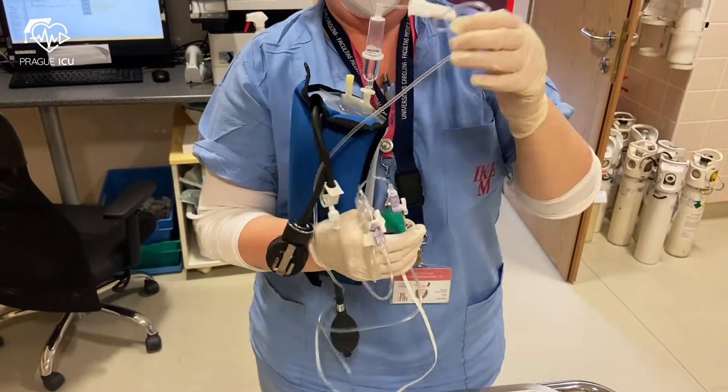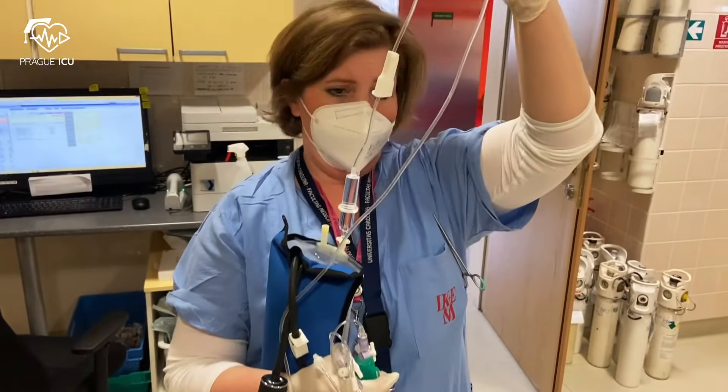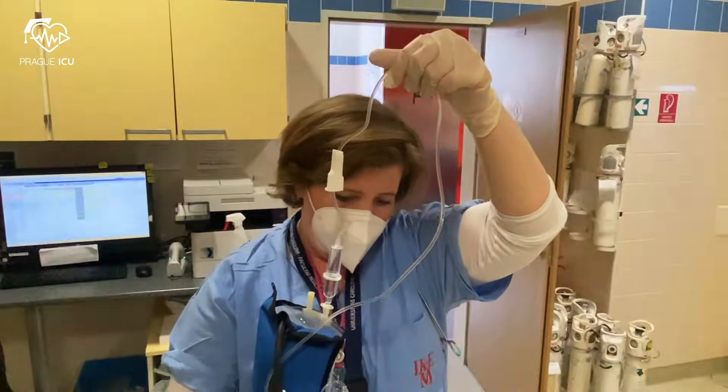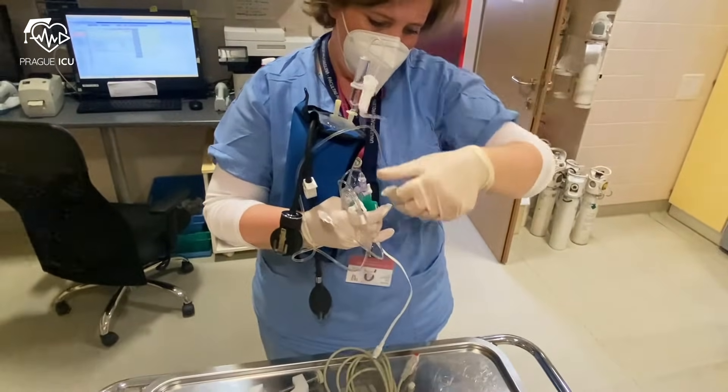You turn the bag upside down for priming the tubing system. You need to make sure that there are no air bubbles left before connecting the line to the patient.